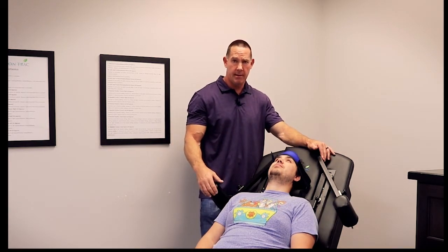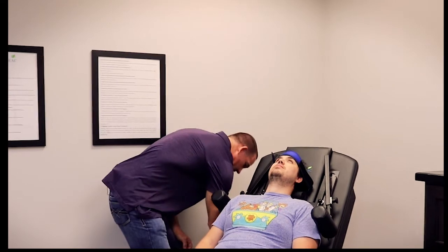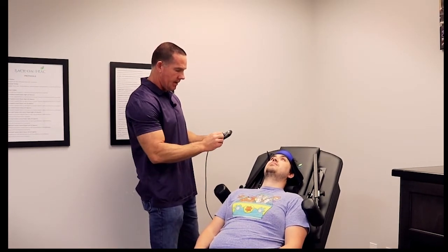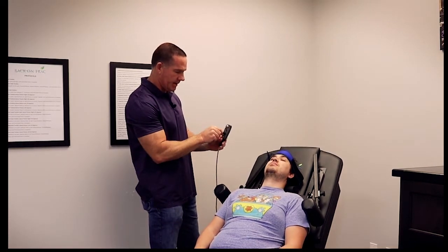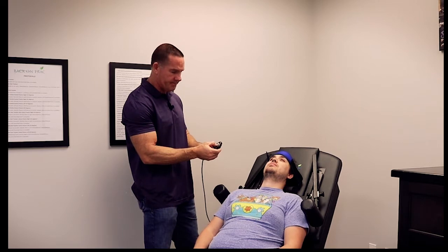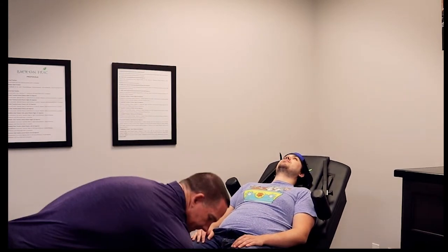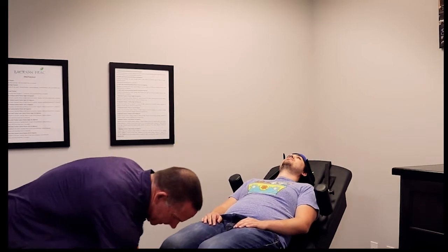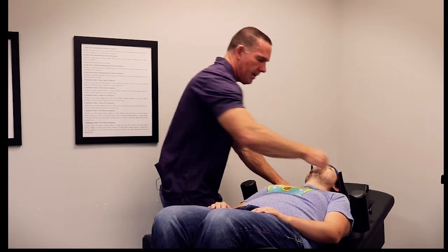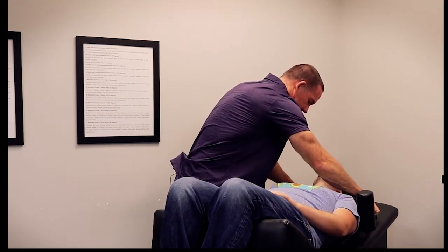The arm bolsters are not used in this. The only thing we use is we strap the feet in when we tip it back. I'm going to set him on protocol C at two and a half inches — this is his first time. We'll put him on five minutes and hit start. I leave these loose because he'll slide up slightly as we tilt in. We're going to strap the feet, put the knees together, strap those feet nice and tight. As he settles in, I'm going to tighten these bolts down. Once he's about three quarters of the way down, he's pretty much good to go — just twist these a couple times and lock them into place.